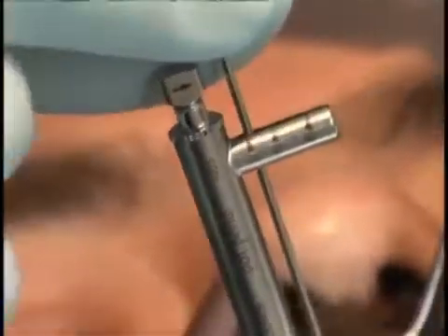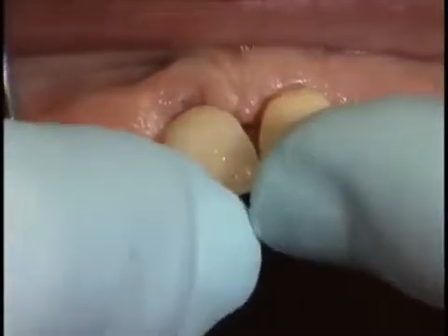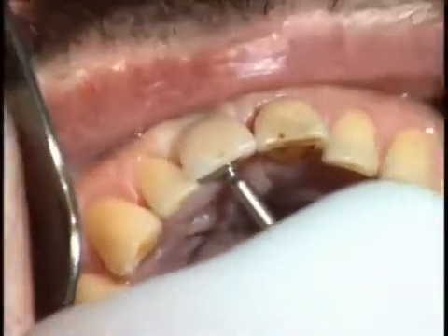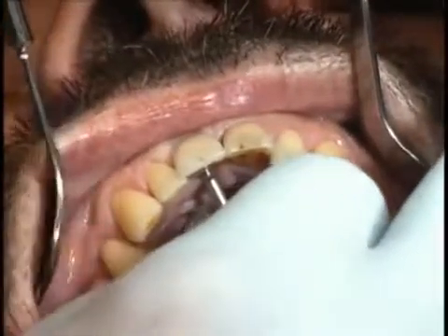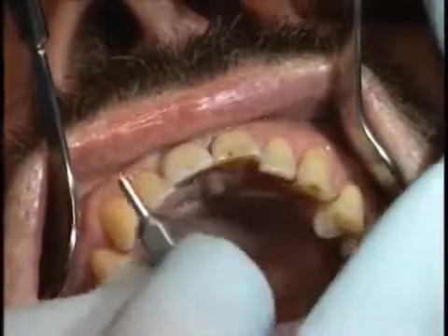Once this is done, the crown fits easily and exactly on the abutment and can be manually screwed in place palatally in a transverse direction using the TS hexagonal screwdriver. The follow-up radiograph shows that the implant is positioned according to the intended long axis and that the crown is placed on the implant shoulder with no marginal gap whatsoever.